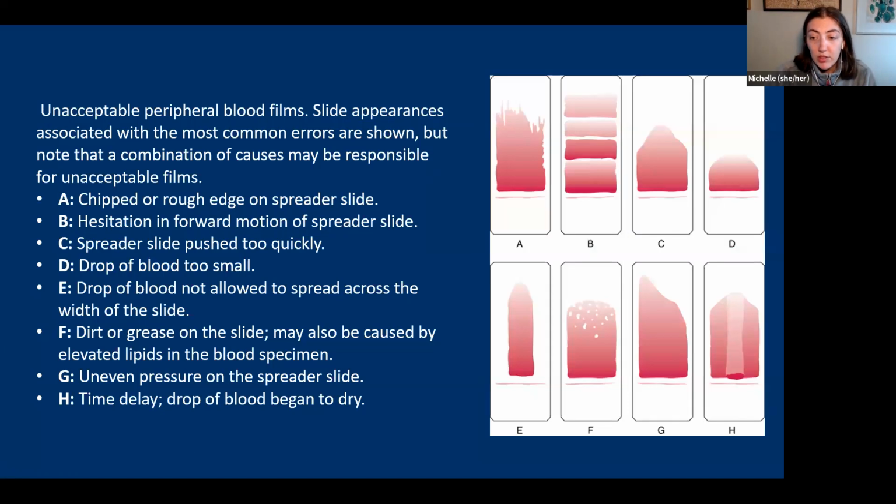Here's another troubleshooting slide. And like I said, I'll make another post specifically about making good blood smears. And then really, for WSU students, I'm here until December, if you want to arrange to meet me in the lab, I will teach you how to make a blood smear. I have not been unsuccessful with getting any student yet to make a good blood smear. So if you think it's not possible, I can help you. I'm happy to meet with anybody and teach you how to make a blood smear.